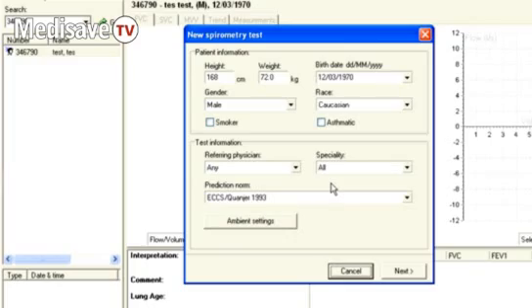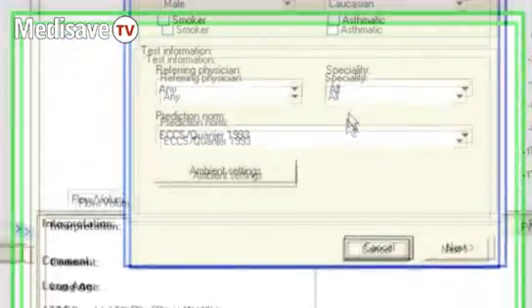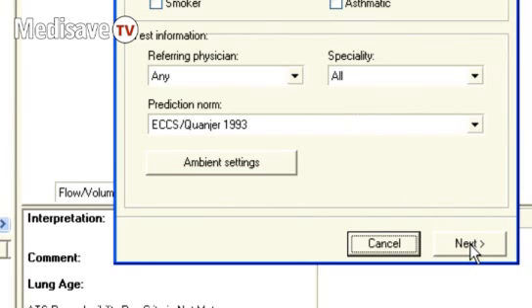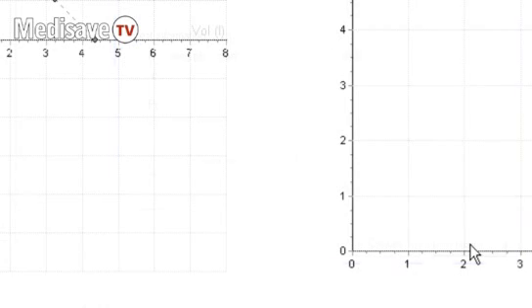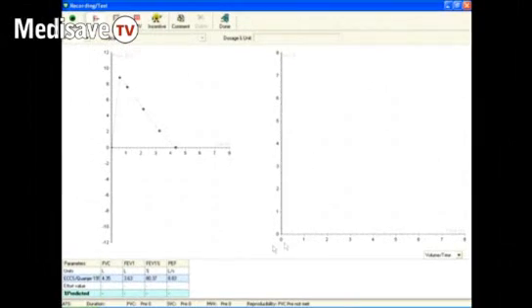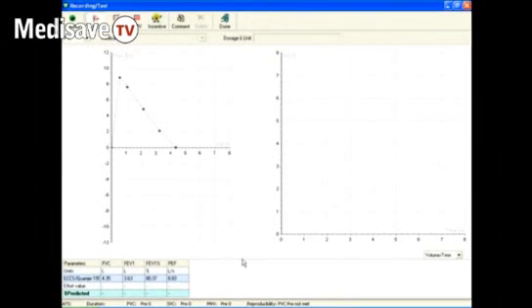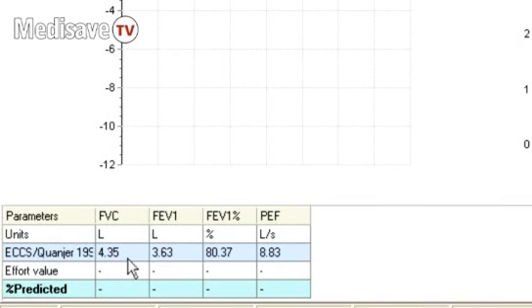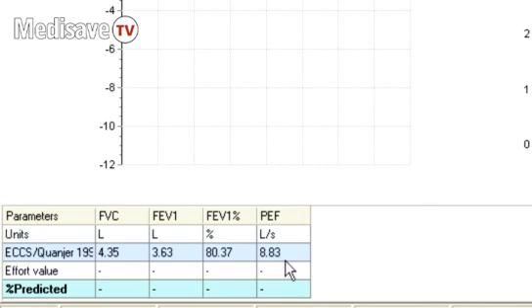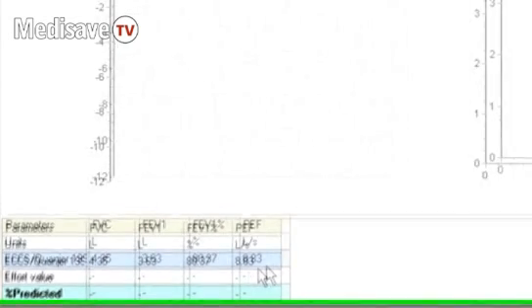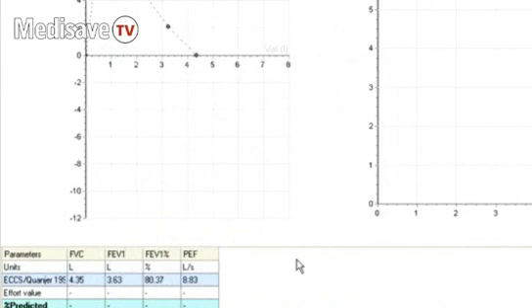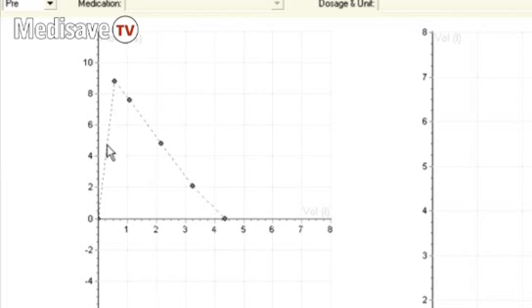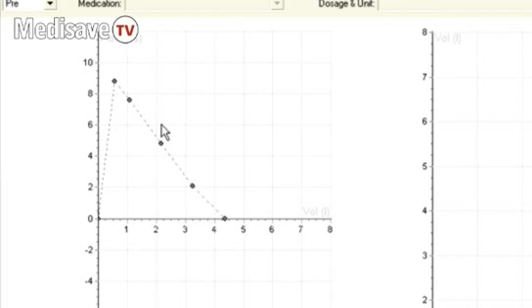Now the PC will confirm back to you the patient's details, and if you're ready to proceed, you just need to click Next. At that point, you'll see on screen the predicted results for the patient based on the details of age, weight, height, etc. that you put in. You also get a predicted curve for the patient in their forced vital capacity test.